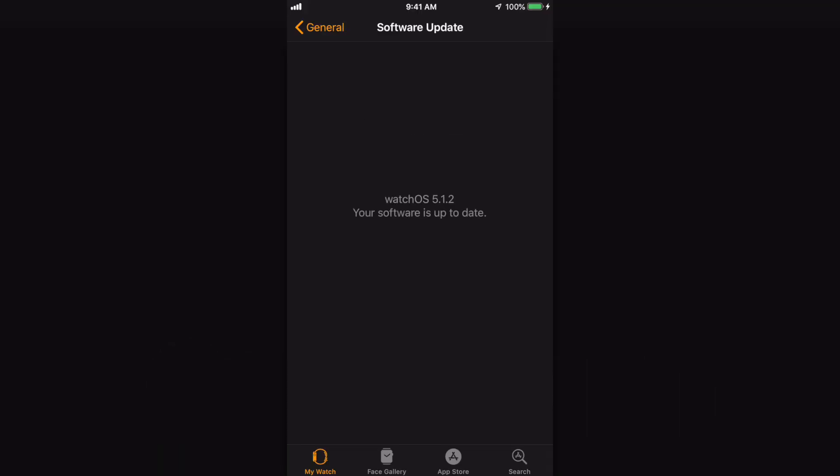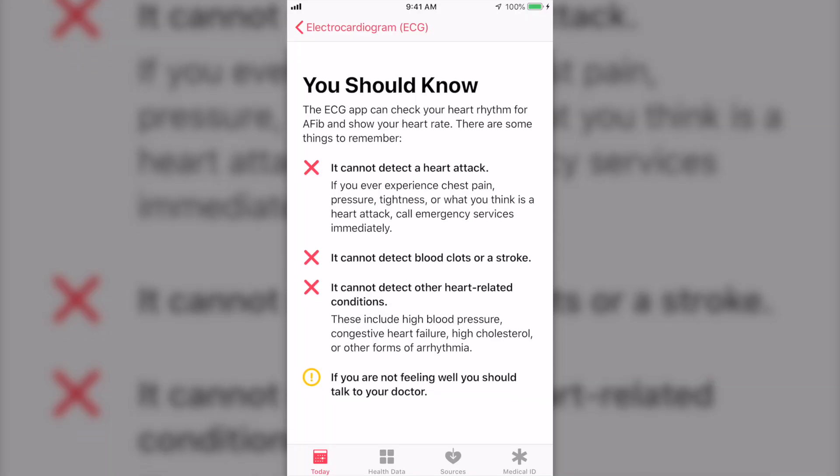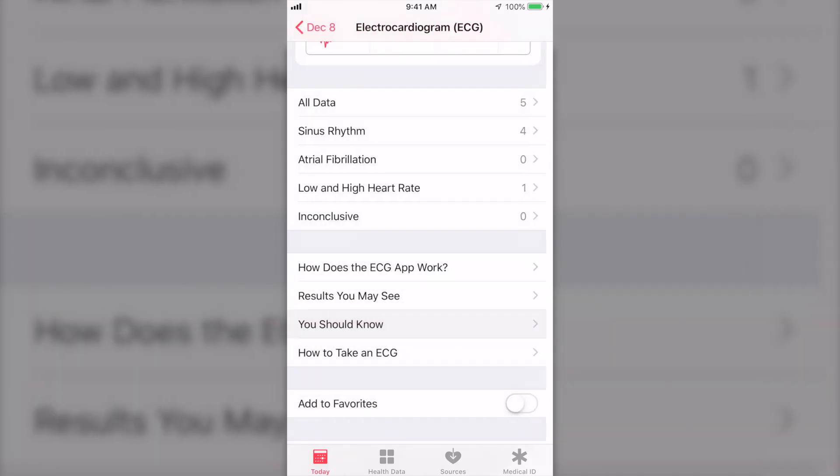In order to enable the functionality, you need to make sure that your watch and your iPhone are updated to the most recent versions of iOS and watchOS. Once you do that and you open up the ECG app on your watch for the first time, or the ECG portion of the Apple Health app for the first time, you're going to be bombarded with a bunch of legal and informational notices.